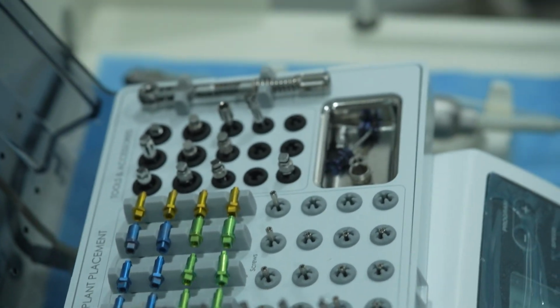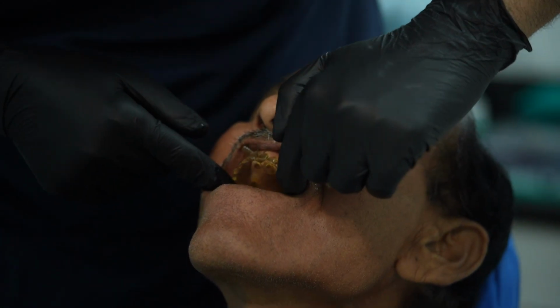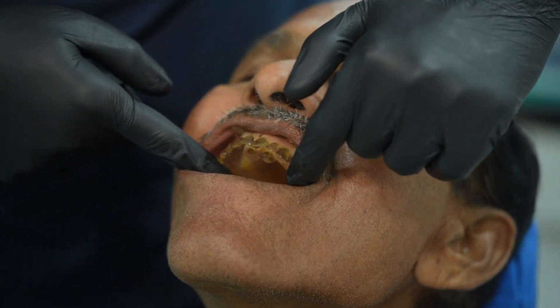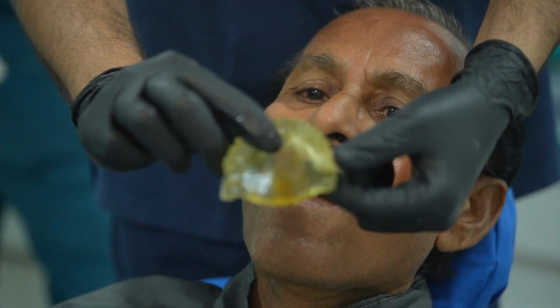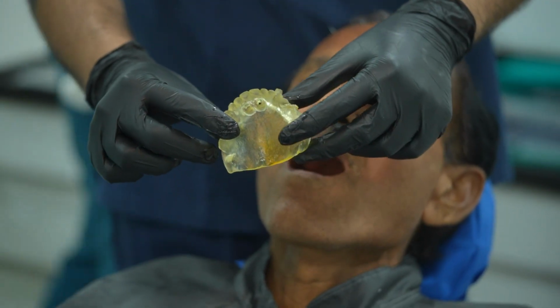So let's go now. The guide which we have prepared is a denture based guide. We are just checking how well it is seating. Okay, it's perfectly sitting. It's a transparent guide, so I can tell, and we have kept it in betadine. That's the guide which we have. I will also show you the procedure of how we converted the denture into our guide.